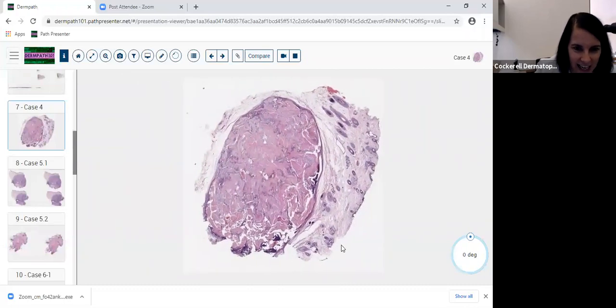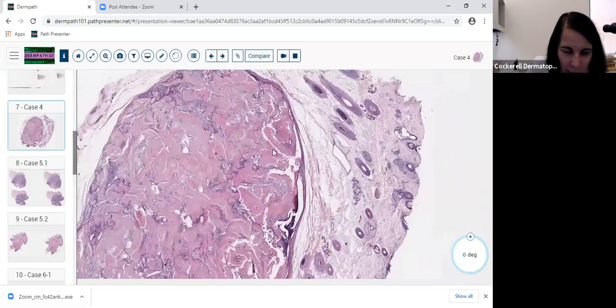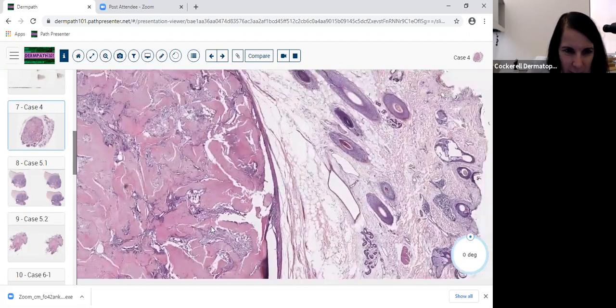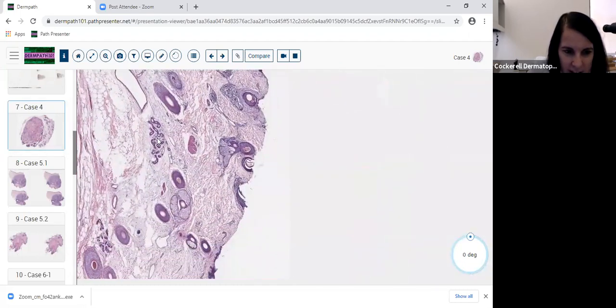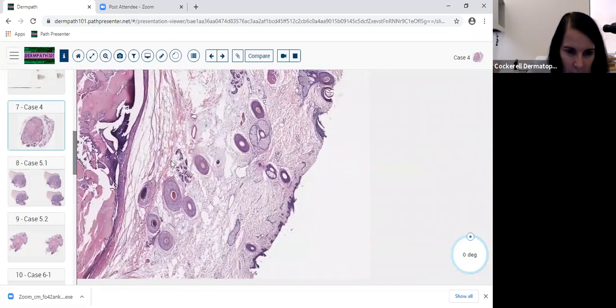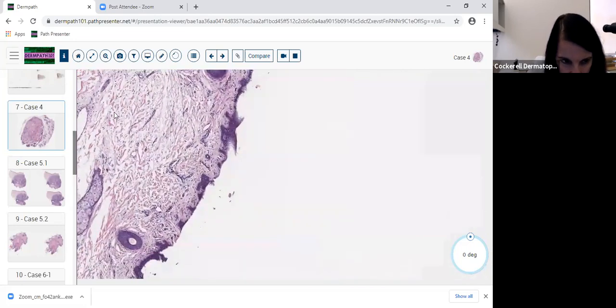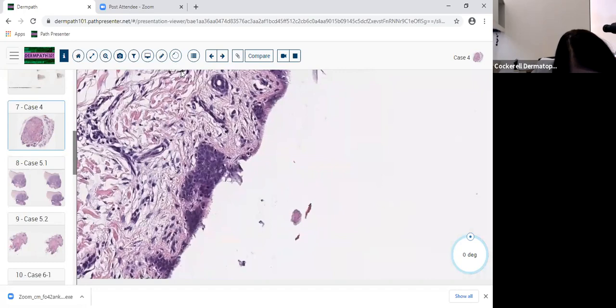This is the next case. And we have a beautiful nodule here that's very well circumscribed. Is it encapsulated? Well, we want to hone in, and I always try to look at the periphery first. We're missing some epidermis here, so it's not going to be helpful. It's a little bit tangentially cut. But the epidermis I can see, there's nothing going on up there. There's no malignancy of these cells here.